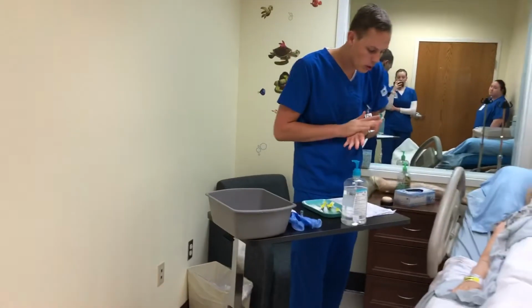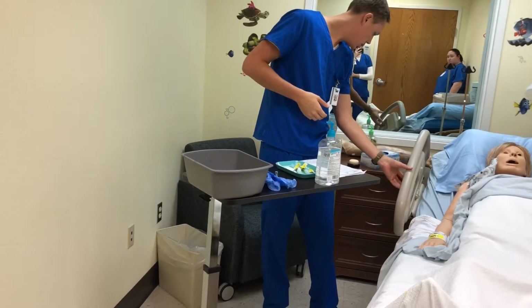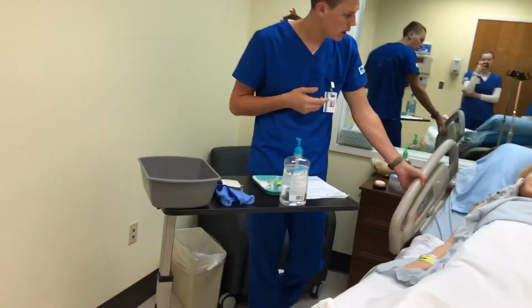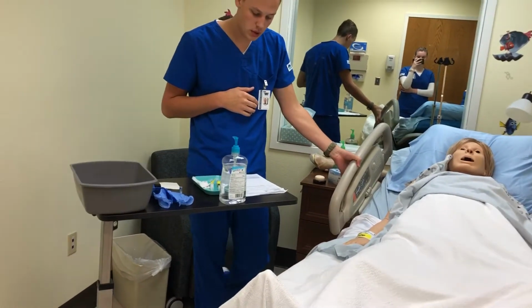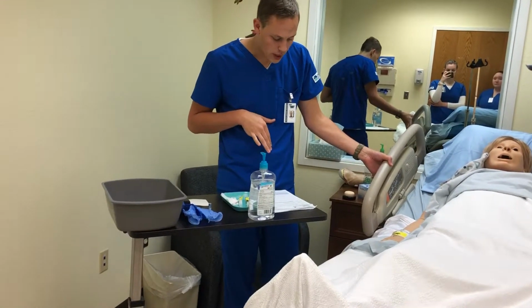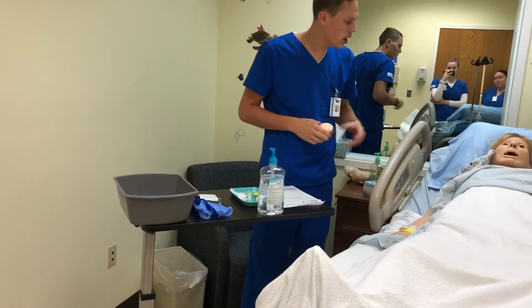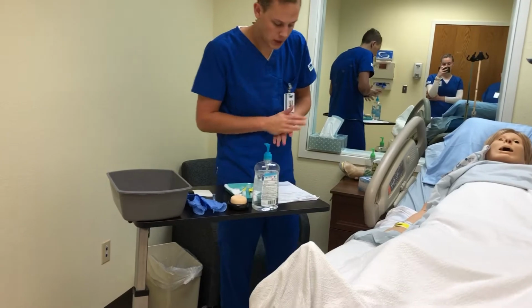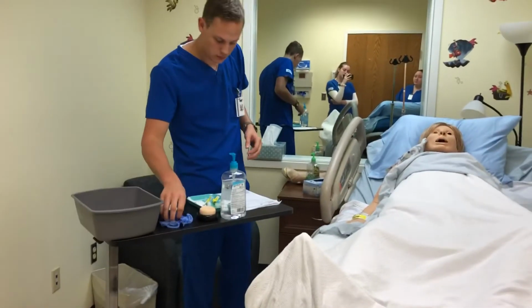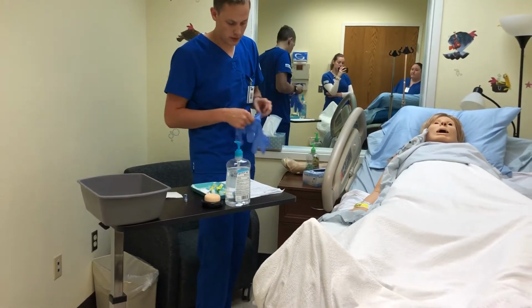So I'm going to have my gloves here. And so just to go over with you, Shirley, I got a PPD test, which is your tuberculosis test. We're going to be doing that. And then I also have your Phenergan, because when I was in here earlier, you were saying that you were a little nauseous. Are you still nauseous? Yeah? Okay. So we'll give that to you too. And so now that I can give that final check, I'll put on gloves.